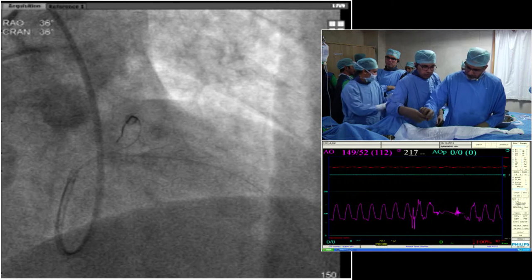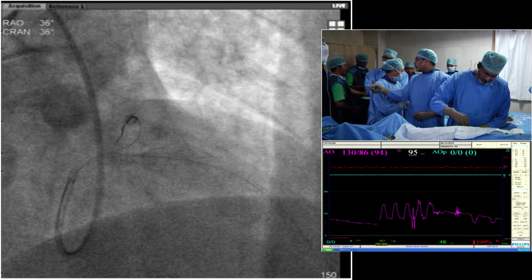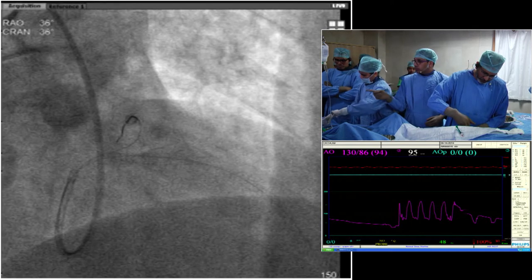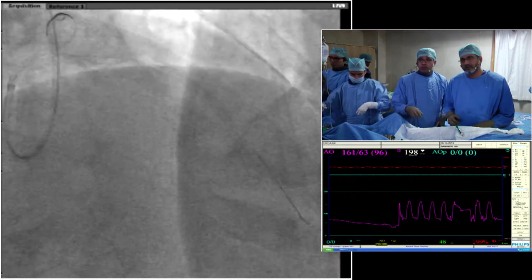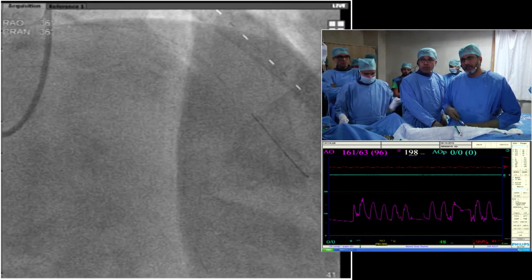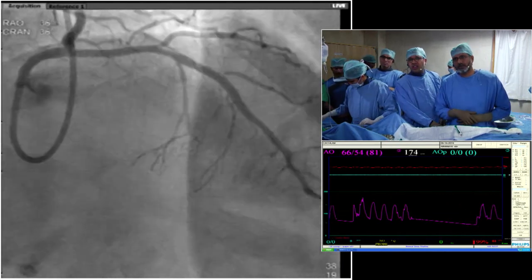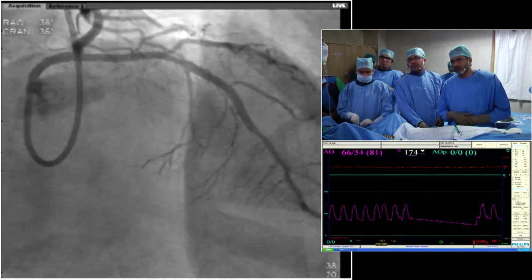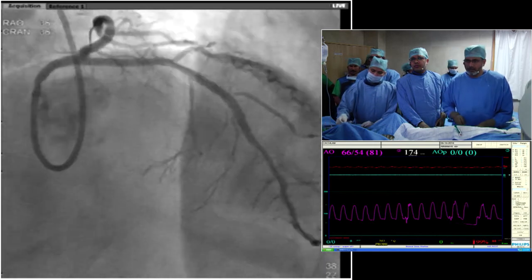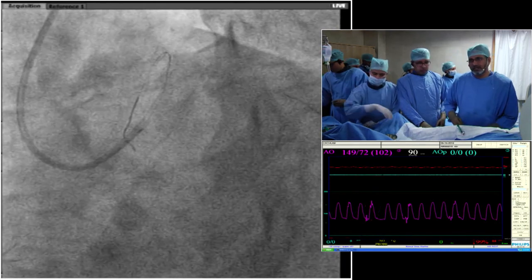So we're just talking about sizing of stents in the left main. It's a sizable vessel, so I wonder what your target is for achieving adequate apposition and how you're going to measure that after you implant the stent. What I would like to do now is post dilate the left main into the ostial LAD segment to 3.5, and then do an OCT and see. It looks pretty okay: the proximal LAD segment, the diagonal, and the intervening segment, everything seems to be okay.